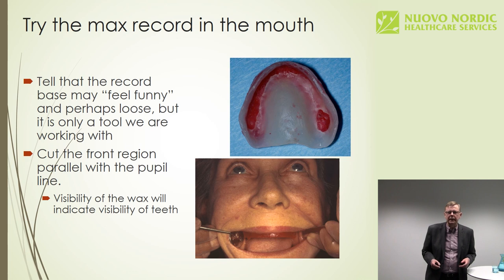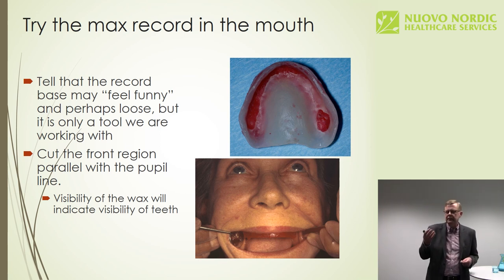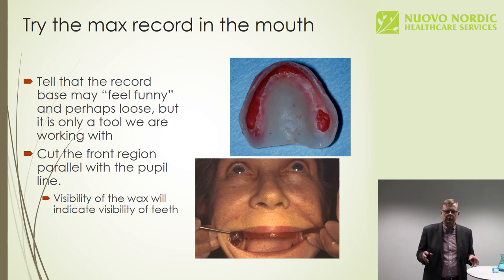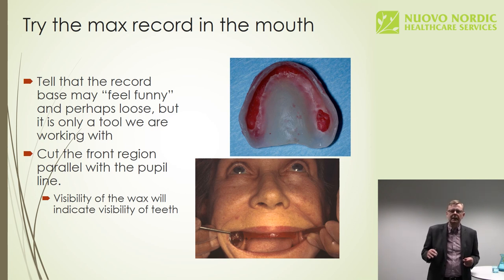When you try the maxillary, and yes, you will try the maxillary jaw relation record first in the mouth, you have to explain to the patient that this has nothing to do with the denture. There's literally nothing in this piece of wax and acrylic of the final product. However, this is only a tool. The patient will understand.